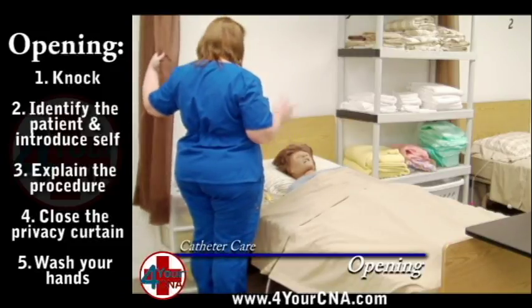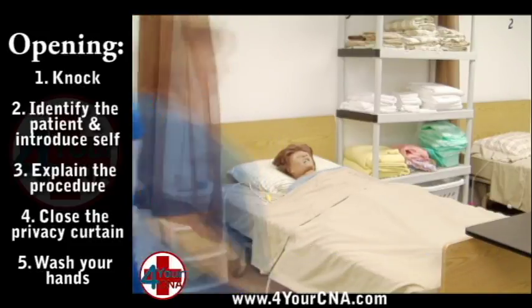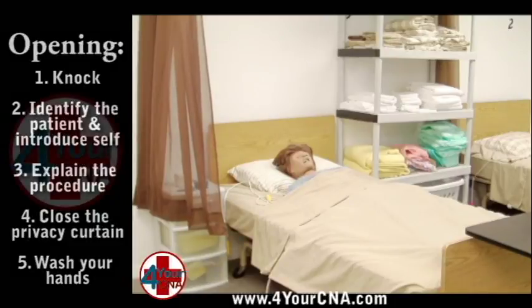Close the curtain and wash your hands. When you return, explain to the patient what you will be doing.